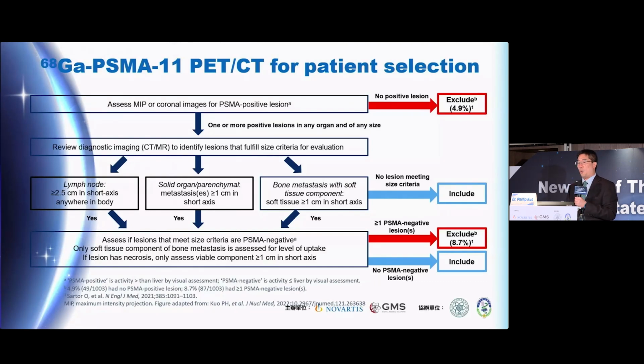There are many reasons, but having two PET scans to look at and then compare actually makes this much more complex and would reduce the reproducibility. Second, we knew with high probability that whatever we did in the trial was going to be how it was approved by the FDA.